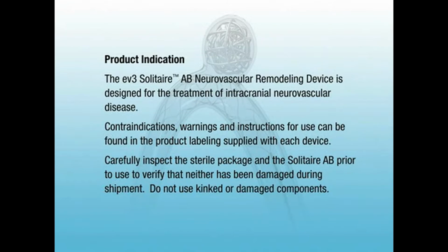The EV3 Solitaire AB neurovascular remodeling device is designed for the treatment of intracranial neurovascular disease. Contraindications, warnings, and instructions for use can be found in the product labeling supplied with each device. Carefully inspect the sterile package and the Solitaire AB prior to use to verify that neither has been damaged during shipment. Do not use kinked or damaged components.